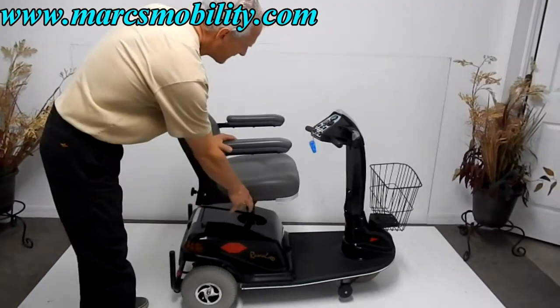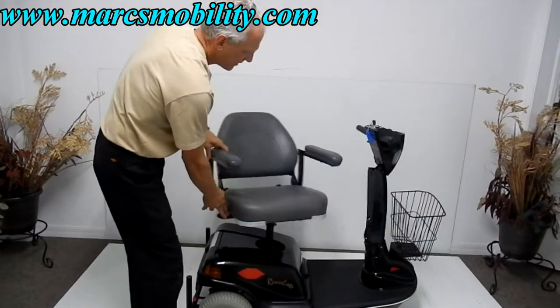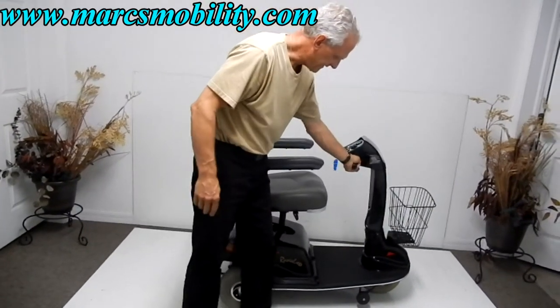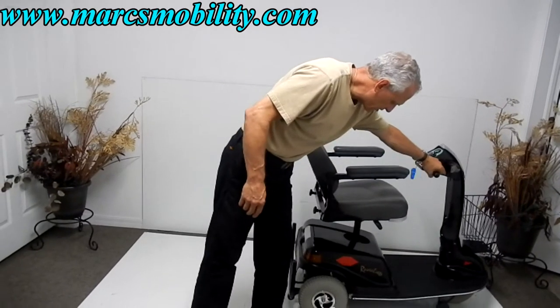The nice thing about this is it's a swivel seat — you can still swivel your seat even when it's elevated. And you can still drive the chair when the seat is elevated.